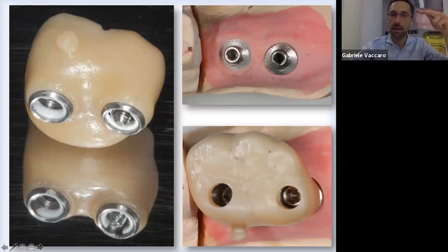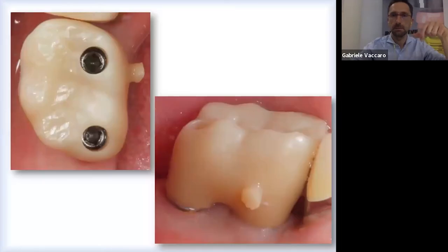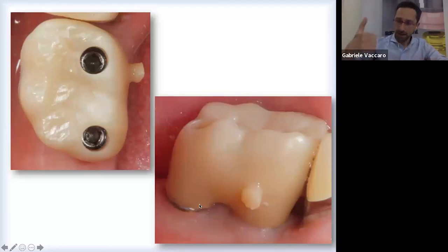And the third passivation system is the seeger ring inside. This is a plastic ring that works as a stress absorber system. Now the seeger ring and the equator help me a lot when I have to try the match between the two components, because I hear a perfectly audible click when I clip on the teeth over the two implants. After that, I screw up everything and check that my connection is perfectly matched.